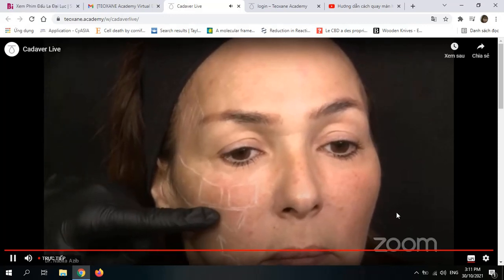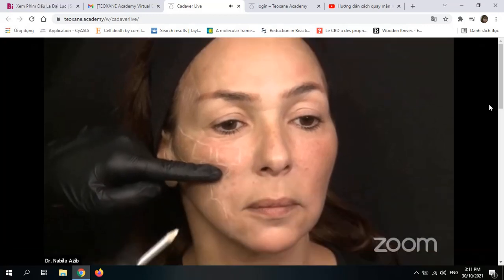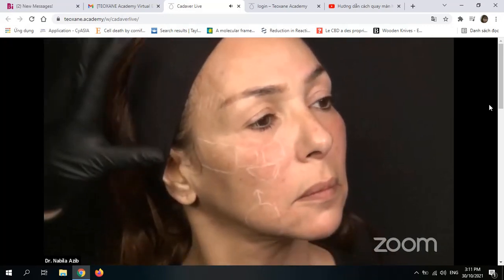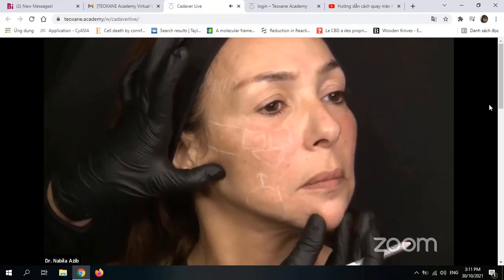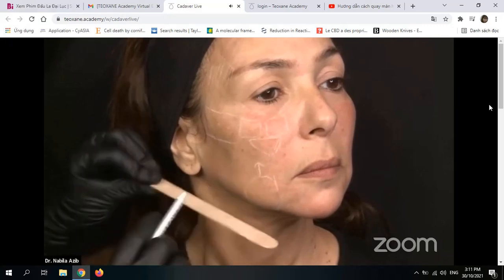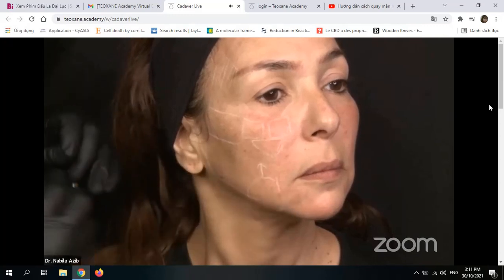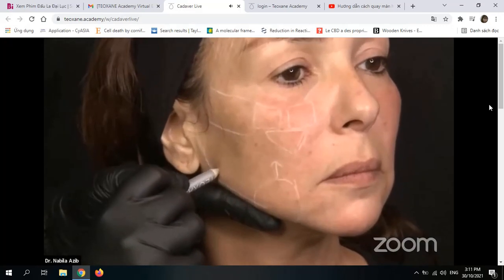So as I told you, this mid-face volume restoration will help me for the vertical support, vertical lifting of the jaw, but I will need to stretch this jaw back and also forward, like this. So here I will be using what we call the Texas technique, which is to better define the pre-jaw and to project the mandibular angle.